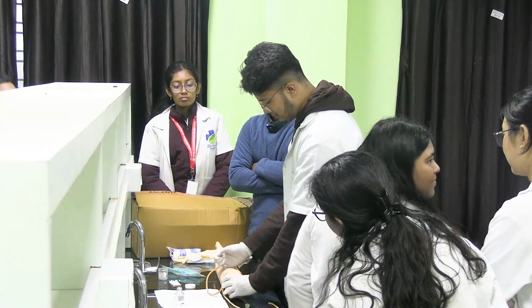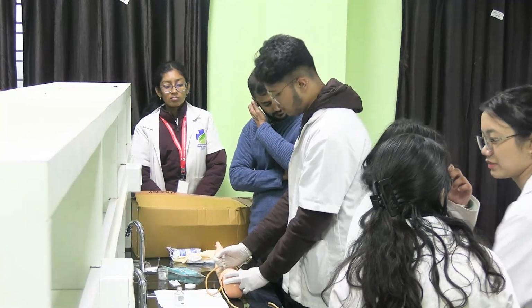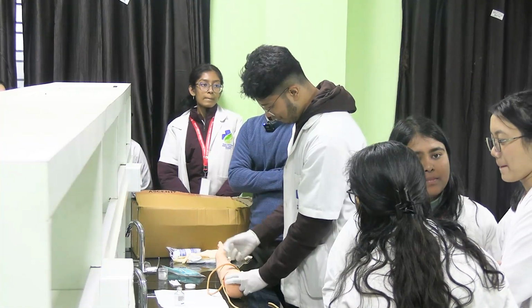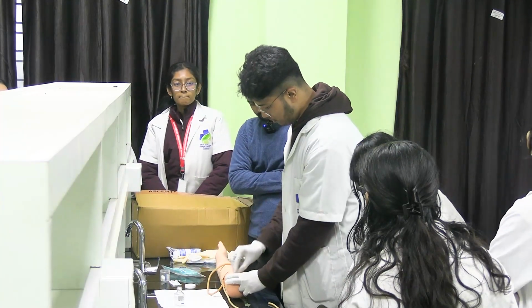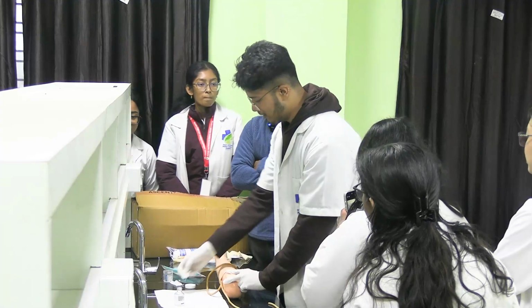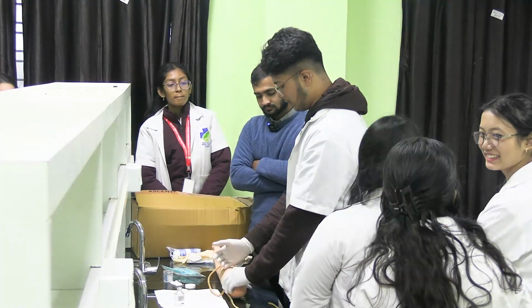How will you localize the part? Sir, two fingers down from the acromion process, sir. Once. Then thrice. Okay. Then I'll wait for it to air dry.